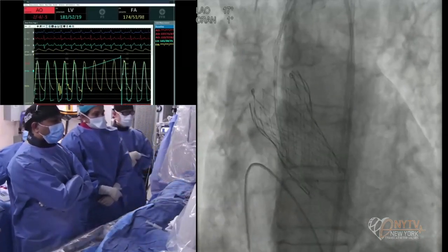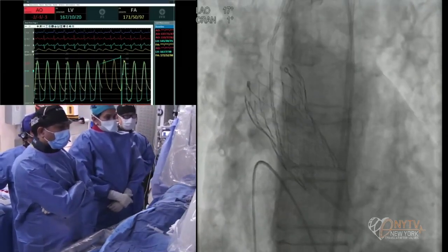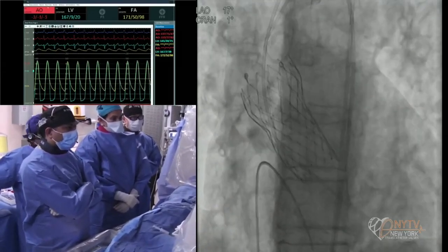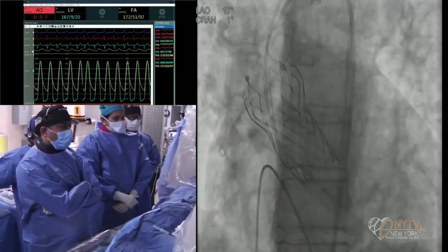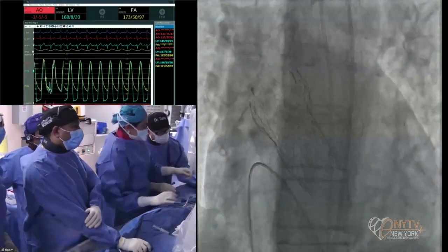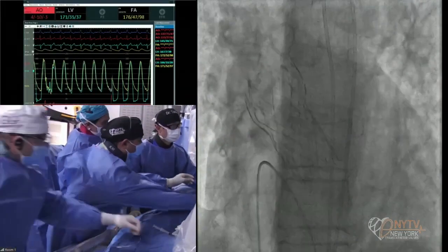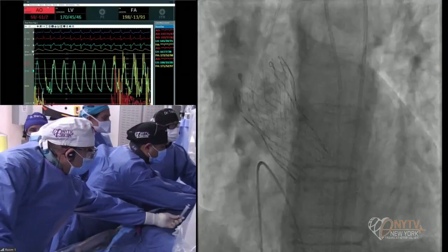So here's the final result. No systolic, diastolic has gone up, but still low. And maybe there is still a little bit of leak, paravalvular or central, maybe because of the pigtail. We'll pull it out and take another aortogram. Anu? Well, it could be just aortic compliance too, right? I was expecting that because the initial aortogram didn't show much AR.